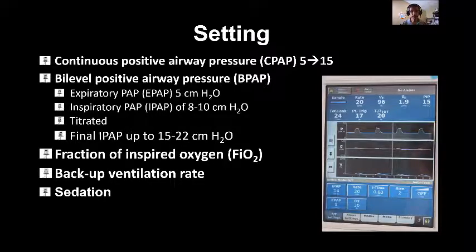And then you need the backup rate. This depends on how much the patient is breathing. If the patient is breathing normally, you don't need to set any. But if the patient is not breathing, you need to set the rate. Usually we go with 20 in most units.